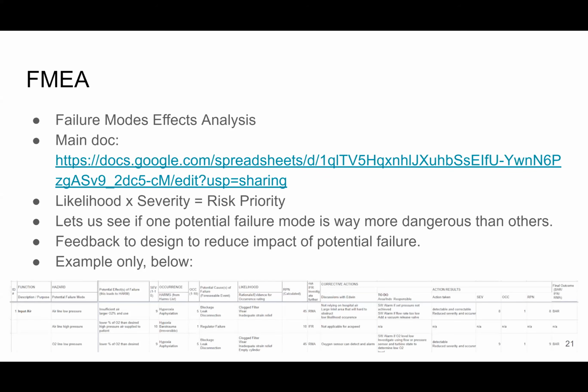Yeah, that's pretty much all for me. I'll just briefly answer Derek's question: we haven't looked at ultrasonic flow meters or other sonic flow meters. Based on my experience, they're a little pricey, but I haven't looked again in this regime. And if that's really what we need, then that's what we need. So I think it's worth exploring for sure.